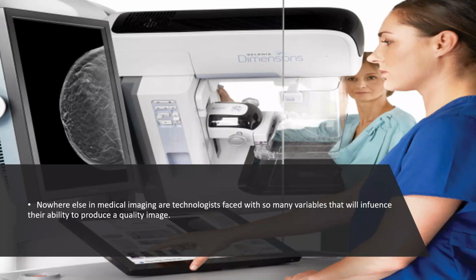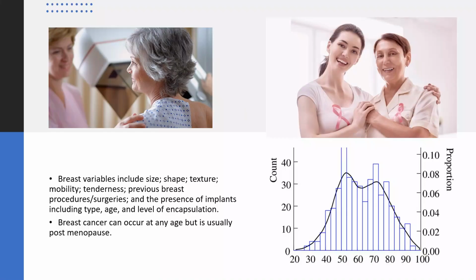Nowhere else in medical imaging are technologists or mammographers faced with so many variables that will influence their ability to produce a quality image. These variables include size, shape, texture, mobility, and tenderness, as well as previous breast procedures. The breast may also have implants and a level of encapsulation from the implants, and there may be a difference in the implants due to their age and type.